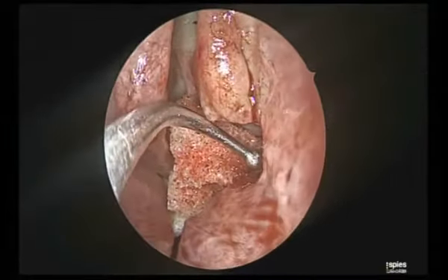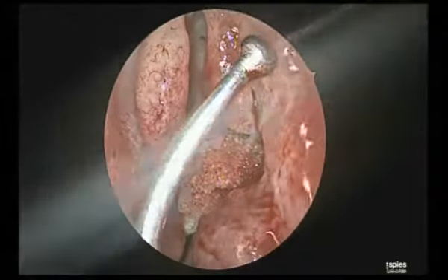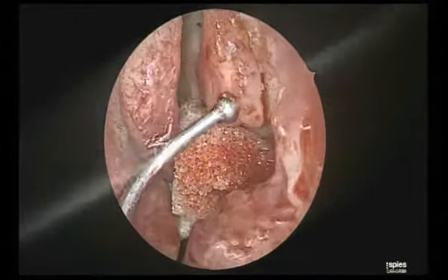That's why I told you to bend your reverse biting forceps a little inferiorly. The nasolacrimal comes like this, and the uncinate goes like this.